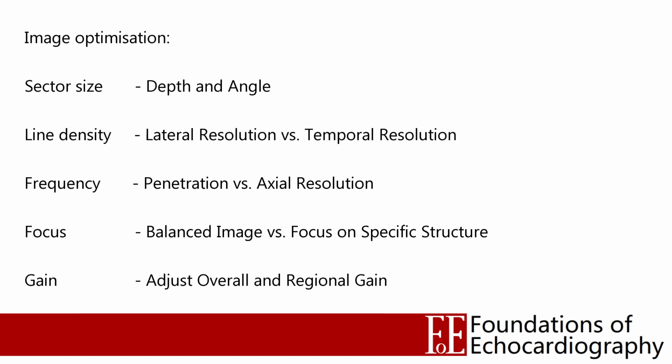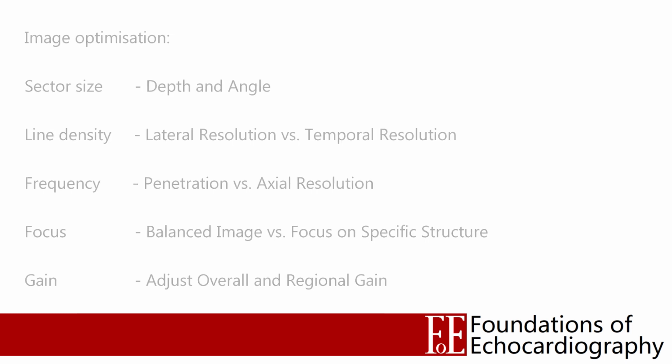Of course, it isn't always possible to produce a perfect image, especially in the sort of patients that are being investigated with a level 1 scan. But if you're able to produce the best image possible in the circumstances, then you've got a greater chance of getting the diagnosis right. Alright, so next up we need to consider artefacts.